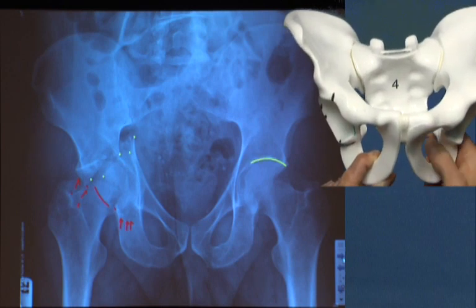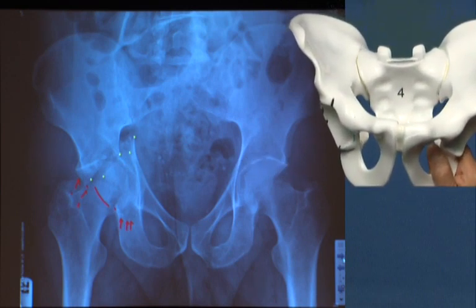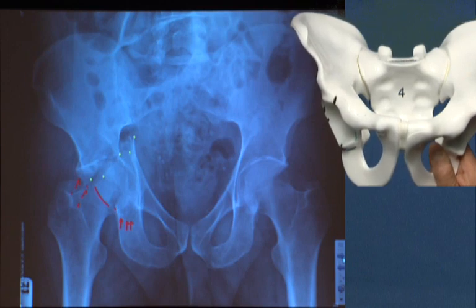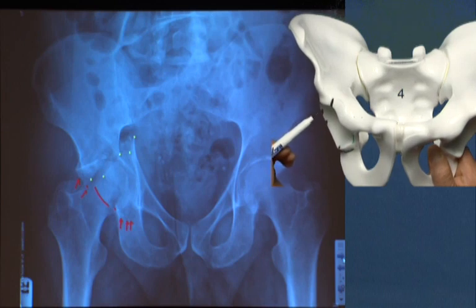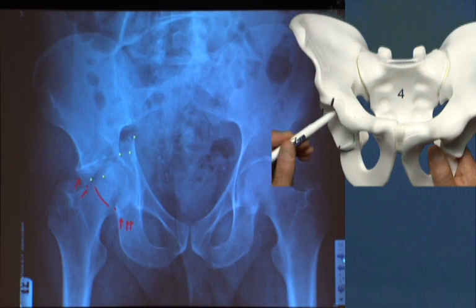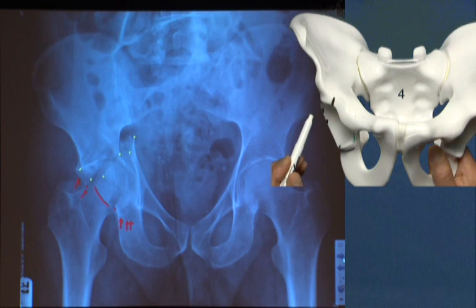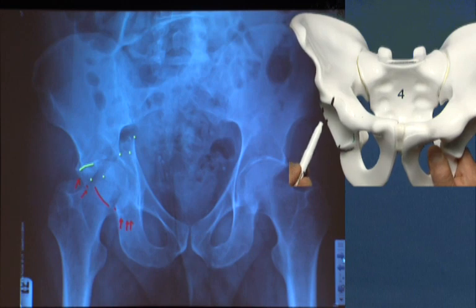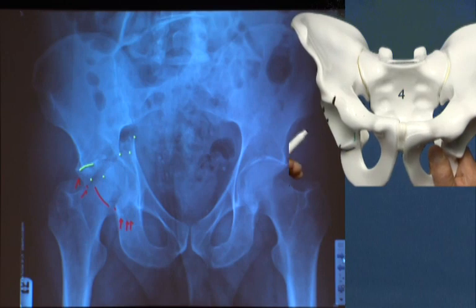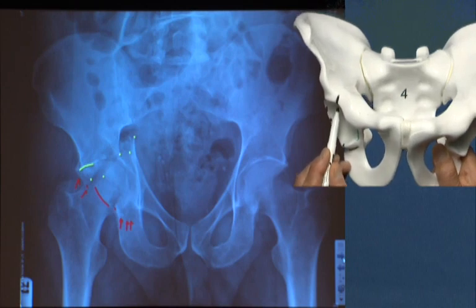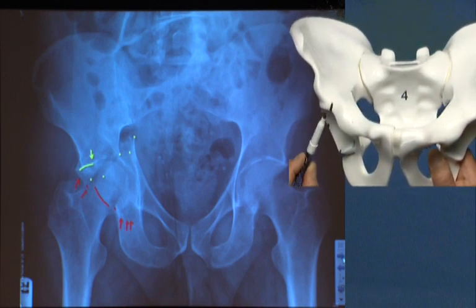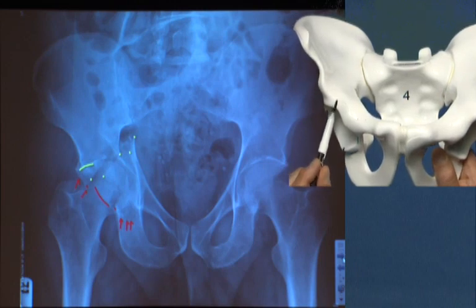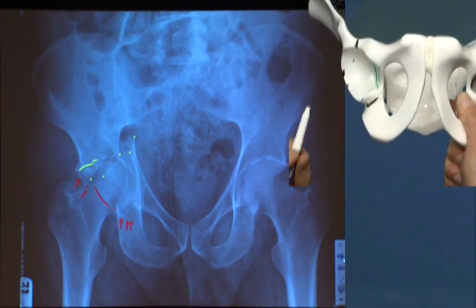What I do see is a disruption of the radiographic roof on the AP shadow. I need to follow the radiographic roof and compare it to the contralateral side — we get so much information by comparing the injured and normal sides. The radiographic roof represents only a very small portion of the cranial aspect of the true sourcil of the acetabulum. I can see the lateral portion of the roof appears to be in its normal anatomic position until about the apex of the acetabulum, where it seems to change direction. Roughly at that point, I'm seeing some disruption of the roof, so I'll put a point on the inside of the roof.